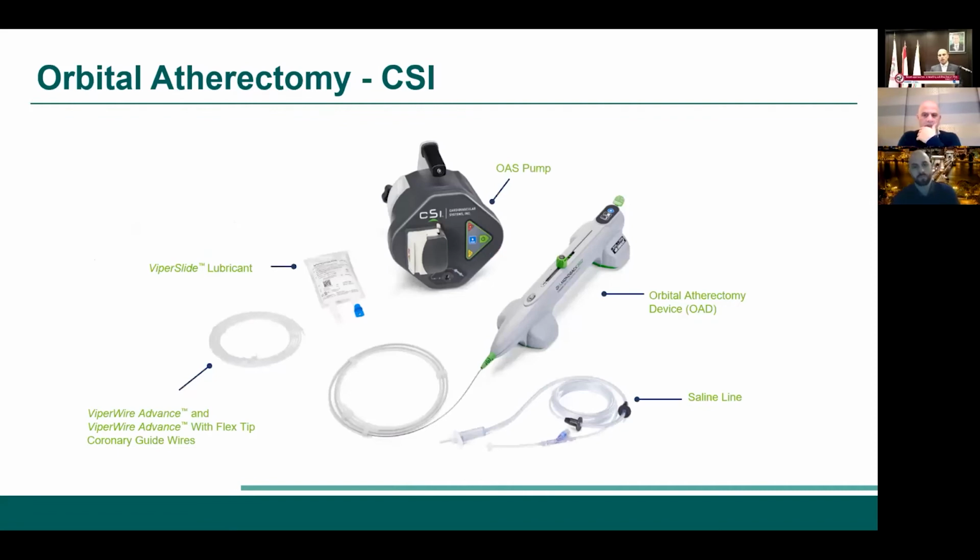Another thing I will show, I know Dr. Shahid already just showed us rotational, RotaPro, the newest improvement, no more pedal, just a new device. This is orbital atherectomy, and orbital atherectomy is available now. It made it to Lebanon. Unfortunately, I don't think any case is done yet, but the machine made it to Lebanon. I think it was stuck for a long time with all the curfews. Only the machine, the catheters, but we just have to do the first case. Yalla.